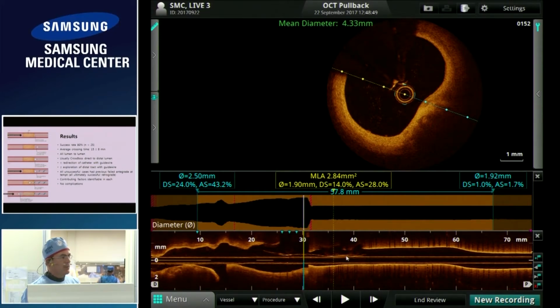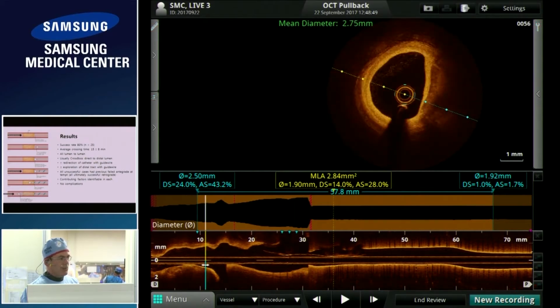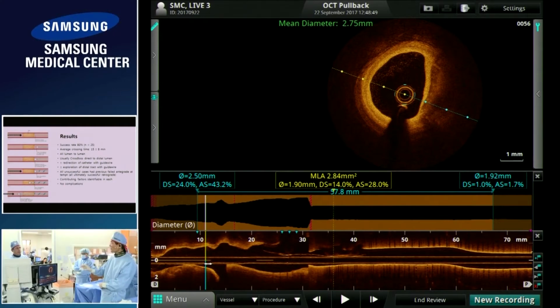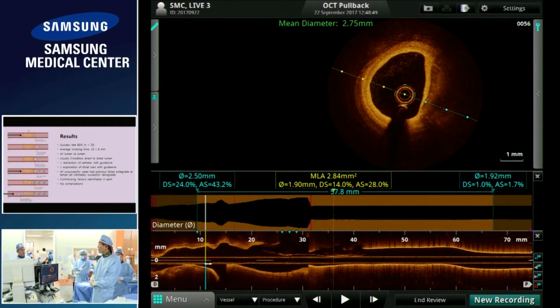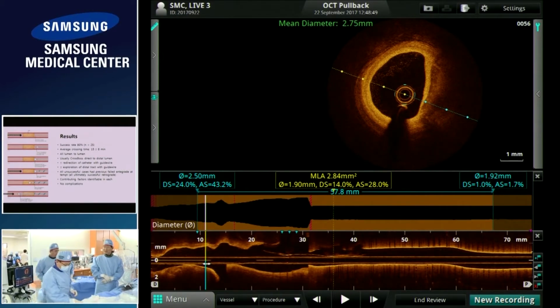So initial stent size was also 3.5. Well, the stent size maybe we can start with the 3.5 if we implant a stent. Sure. 3.5 stent and the 4.5 post-dilatation will optimize. We achieve optimal proximal expansion, I think.